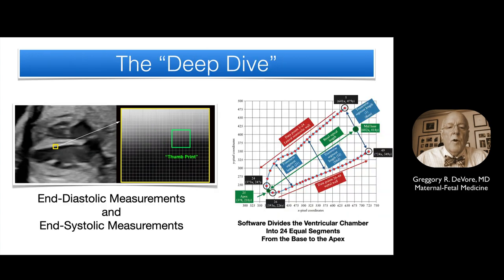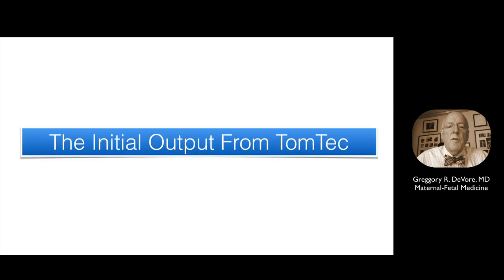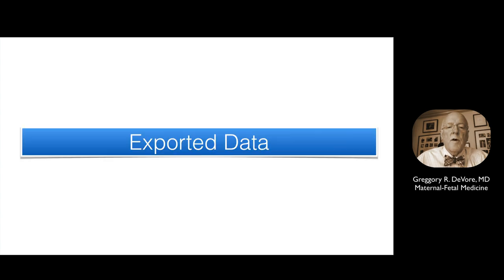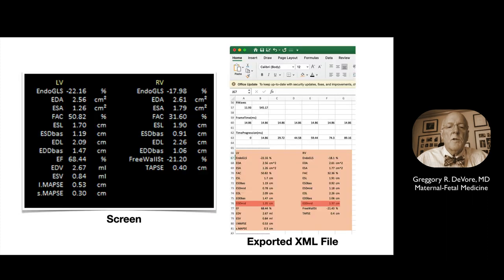From the X and Y coordinates, the software identifies 49 points along the endocardial border and divides the ventricular chamber into 24 equal segments. Segment 1 is at the base, Segment 12 in the mid-chamber, and Segment 21 in the apical area. In addition to the 24-segment widths, the software computes the length and area of the chamber. The TomTec analysis provides the option to download additional measurements. The screen displays strain, length, width, area, and annular plane systolic excursion. The exported XML file also contains an additional measurement of the mid-chamber width not displayed on screen.